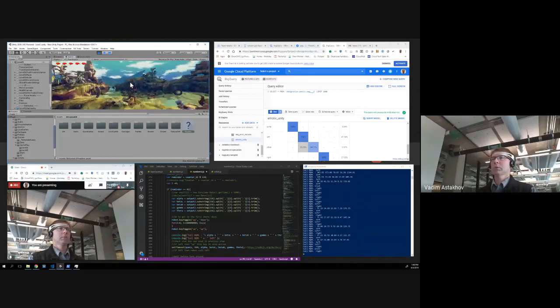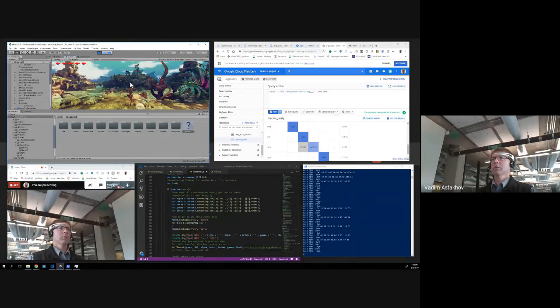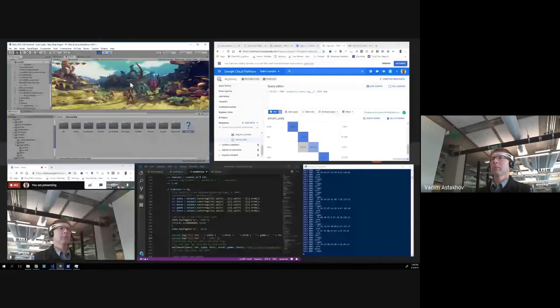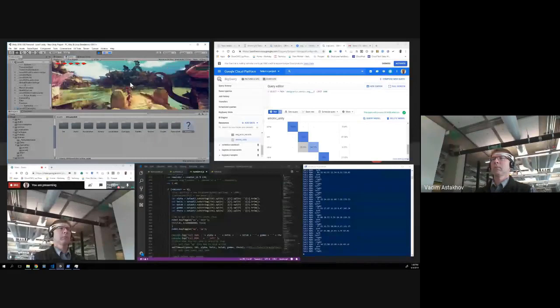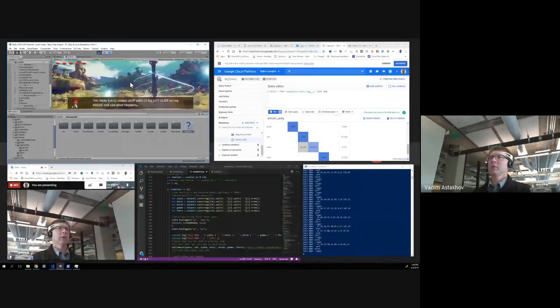And as you can see, this time I was a little bit luckier. And again, I start talking and it automatically intercepts control. We'll see how it goes when I try to talk this time. And obviously I'm lost again. So essentially, at least I demonstrated that potentially you can train a brain-computer interface to operate the environment. At some point, you can actually use your mental commands to activate your avatar, like it's happening right now.